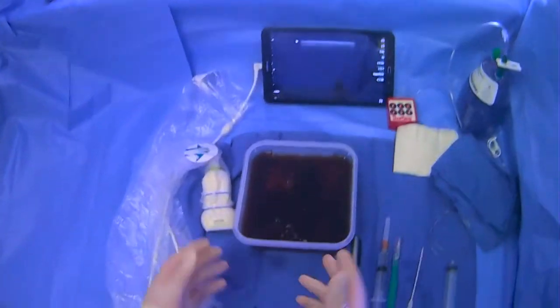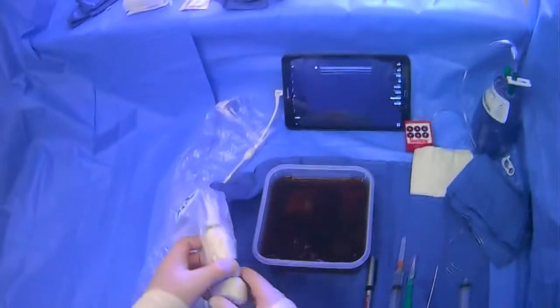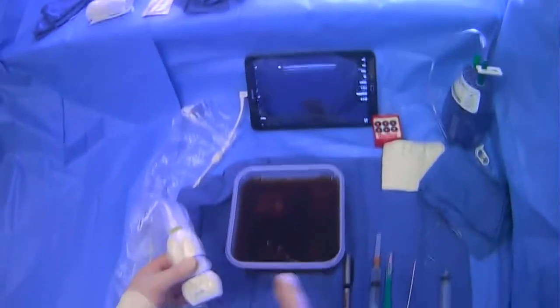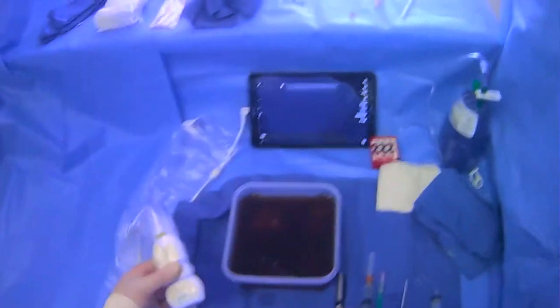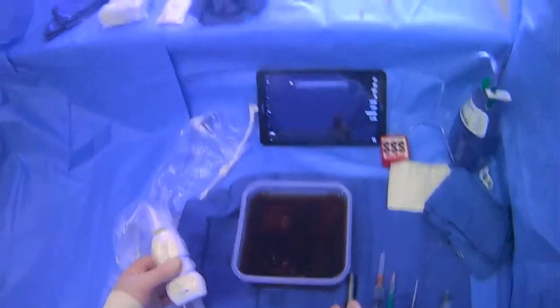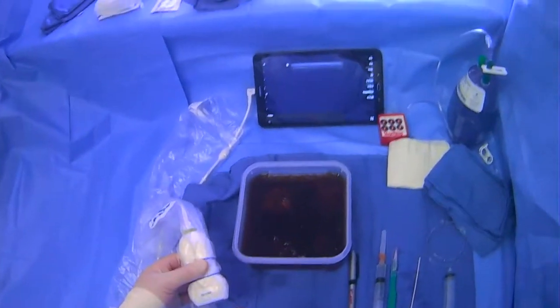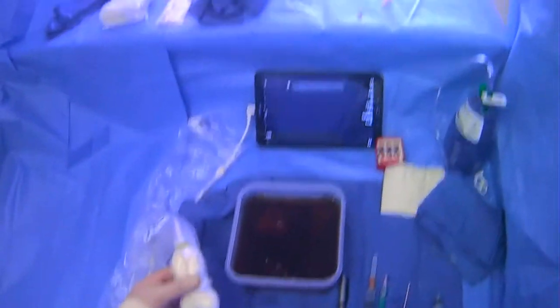You're going to start with scanning to find your target. We are going to use ultrasound. We start with a curved probe so we can get a sense of deeper structures and look throughout the abdomen. But once you find a pocket that looks reasonable, if you can switch to a linear probe, it can be helpful to see things in higher resolution.